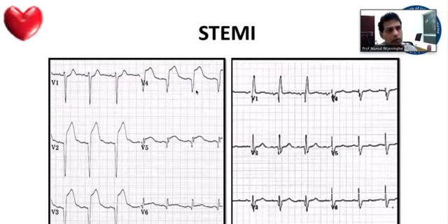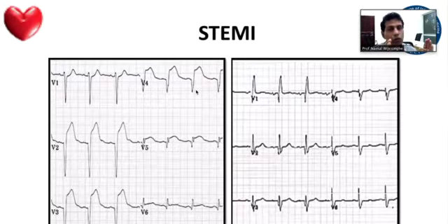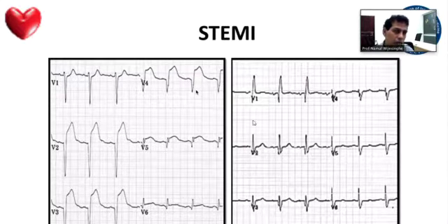In this ECG, the anterior septum and the anterior septal wall are getting damaged. And you can also guess which artery is occluded, which is important for the cardiologist when we do a primary angioplasty.